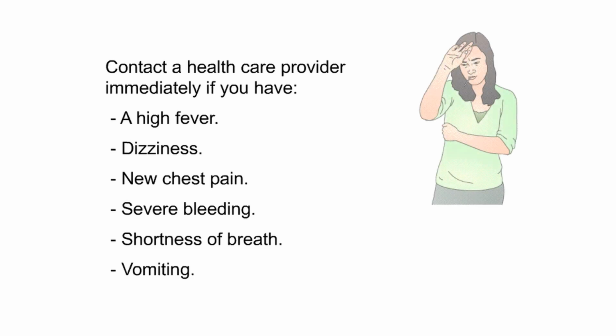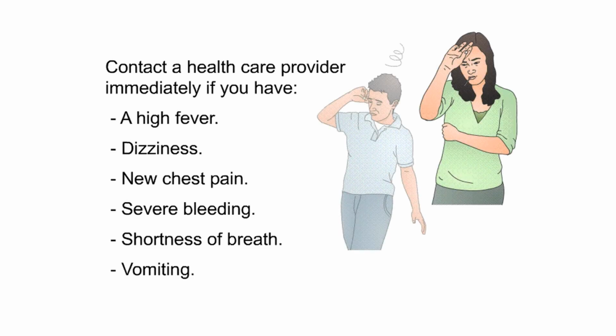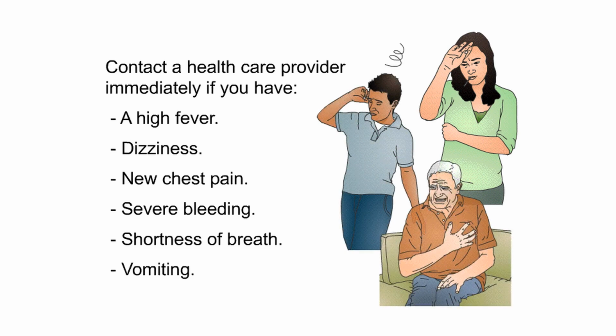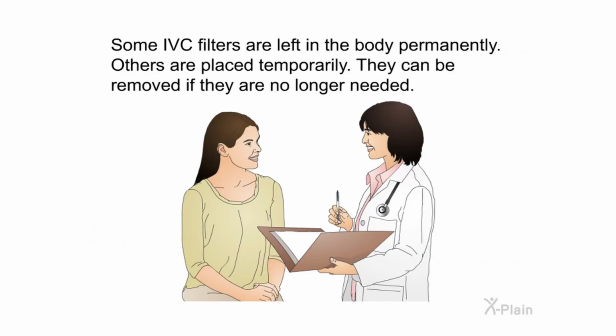Contact a healthcare provider immediately if you have a high fever, dizziness, new chest pain, severe bleeding, shortness of breath, vomiting. Some IVC filters are left in the body permanently. Others are placed temporarily. They can be removed if they are no longer needed.